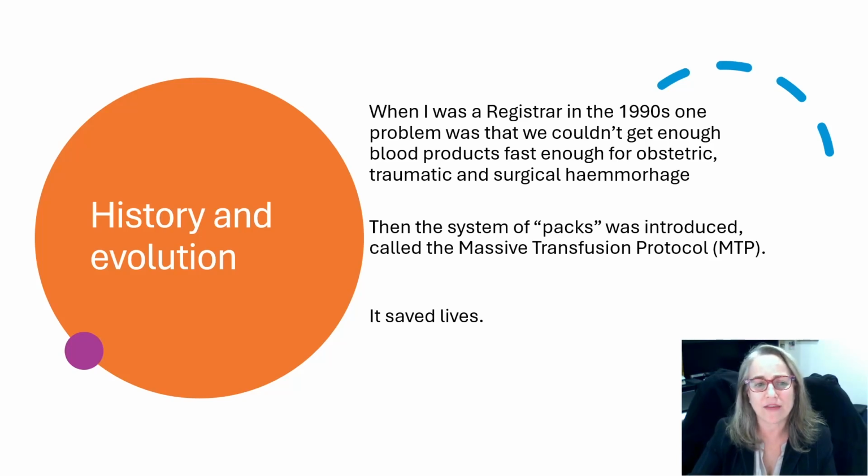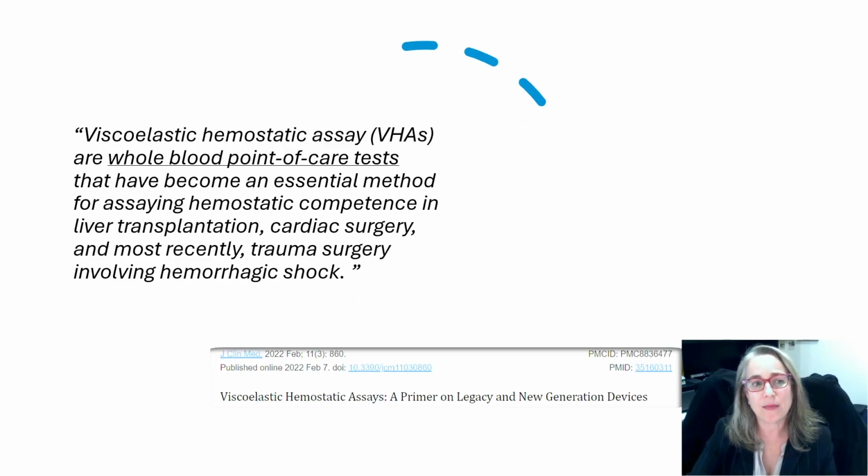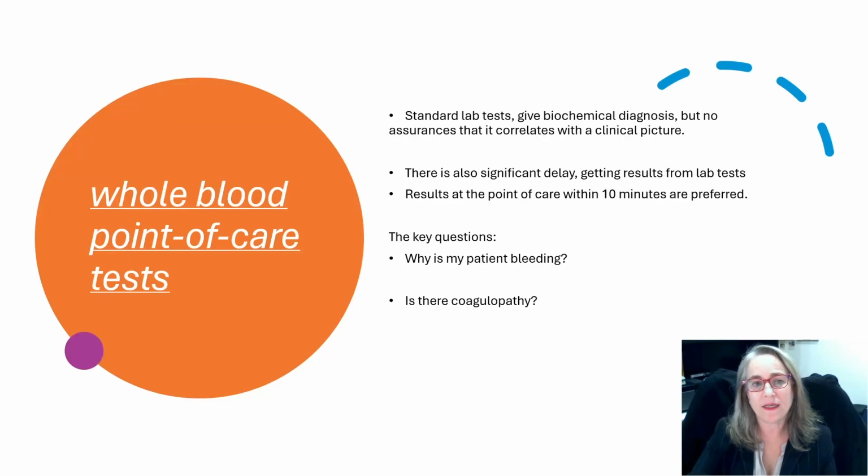Well, I quite like this definition from a paper in 2022. It says viscoelastic haemostatic assays are whole blood point-of-care tests that have become an essential method for assaying haemostatic competence in liver, cardiac, and more recently trauma and haemorrhagic shock. The important points being that they are whole blood and that they are point of care. So let's dive into that a little bit.